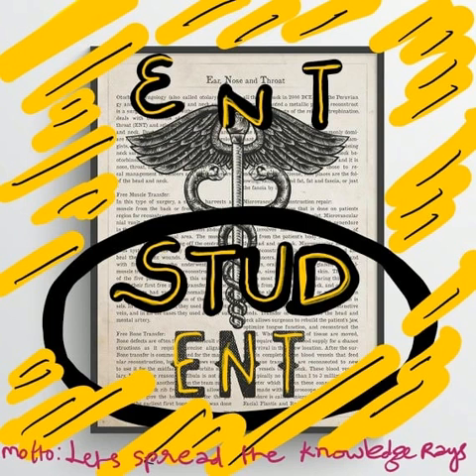So here is the mastoid antrum, with the dome of the lateral semicircular canal in the floor of the antrum. Once the heavier bone is removed over the tegmen plate and sigmoid sinus, thinning is performed with a diamond burr. Stop drilling if a change in the sound of the burr is heard.